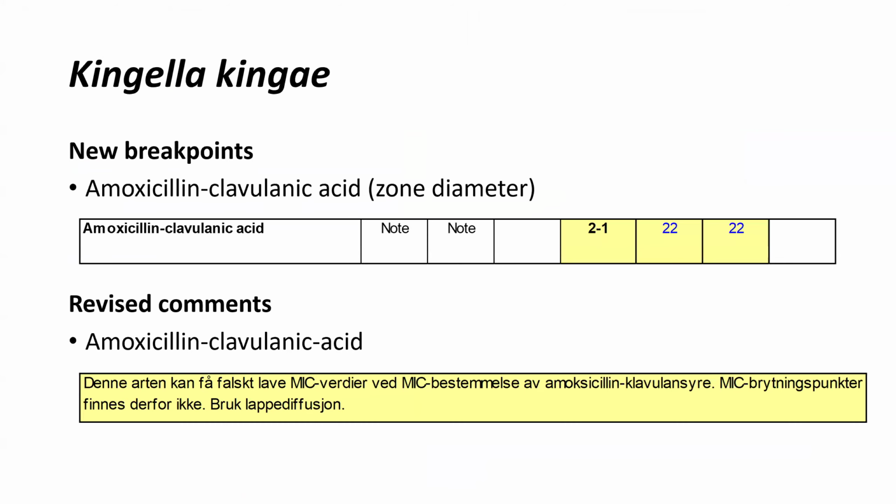And the only thing with Kingella is that we now have its own diameter breakpoint for amoxicillin clavulanic acid, which is then included with comments saying that you can use this diffusion, but there is no MIC method since it often gives you too low or falsely low MIC values. But it's good that we have a breakpoint.